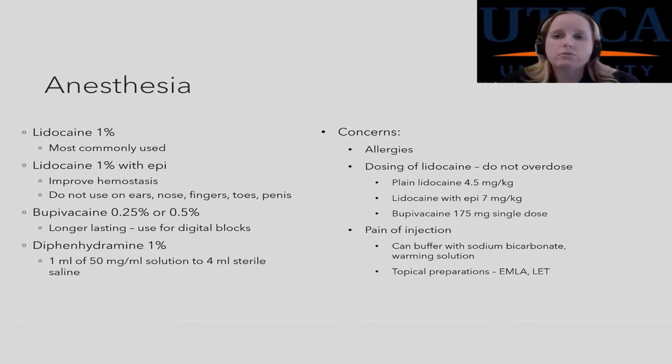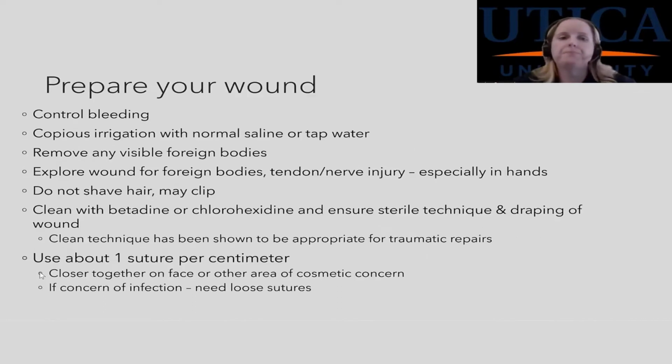You don't use gauze, you only use cotton. Why? Because it soaks into the gauze and not on the skin. But when you put it on cotton, it will not stick to the cotton as much. So that's why you want to use cotton, not gauze. Leave it on for about 30 minutes and then come back and do your procedure. It'll be numb. You'll be able to tell because the skin will be all white around whatever you put it on. That's what you're looking for. Generally, if you put that, you won't need to inject anything. I just use LET and be done with it. And it's great. So that can be very, very helpful.